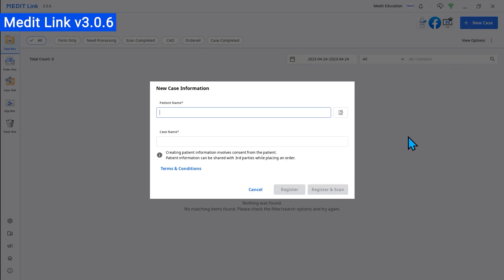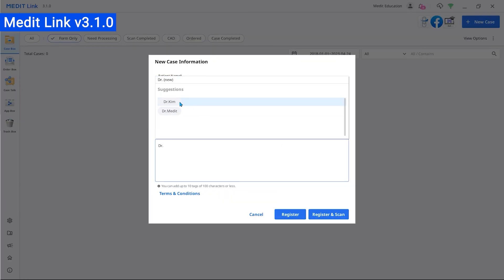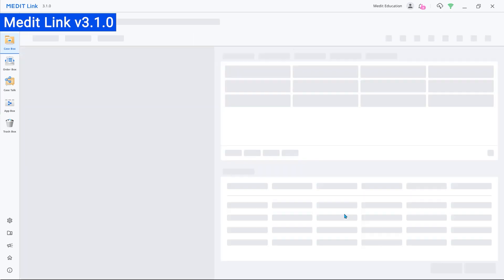First off, we added the Tags feature. Tags can help you quickly enter frequently exchanged details about the case when placing an order.